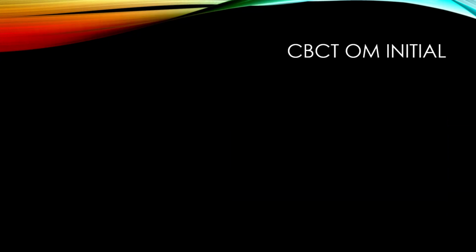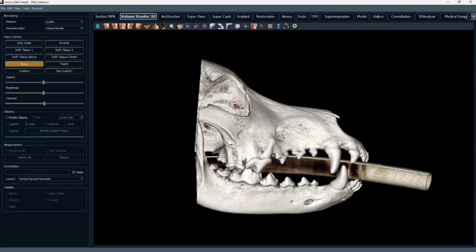So let's take a look at that original cone beam. Again, I like to start in the 3D or the volume render. Like I said, it's kind of a distance exam. So that was on the right side of the dog. Here we are on the right side of the dog, so sort of buccally, the spacing between the teeth is normal. The quality and character of the bone is normal. I don't see any major deformations. I don't see any broken teeth. I don't see anything that seems to be seriously out of order.